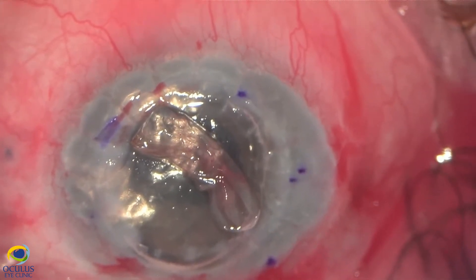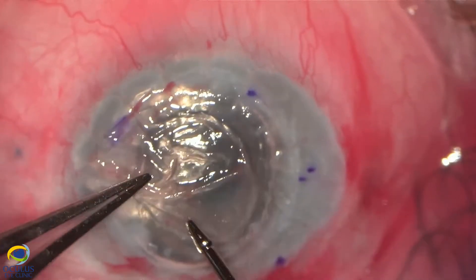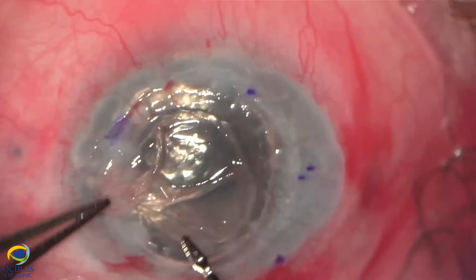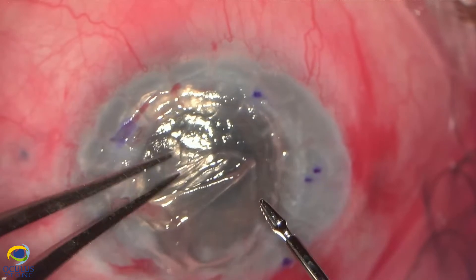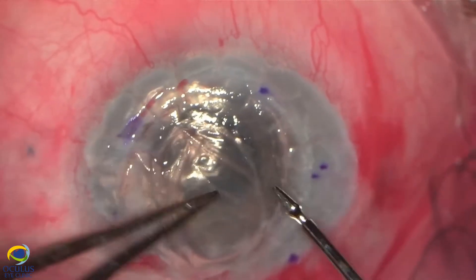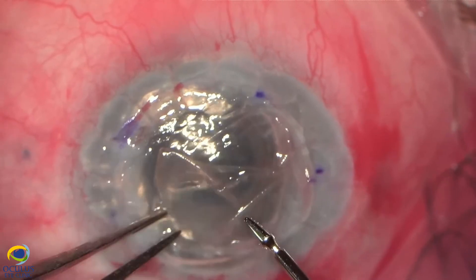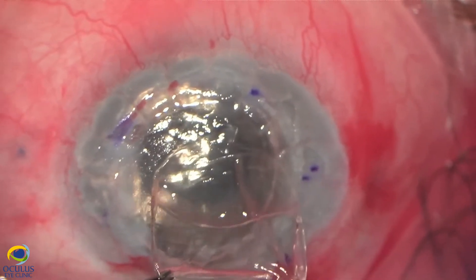The Descemet membrane looks quite thick, which is most probably due to the fact that the graft failed three years ago but the patient postponed the surgery for a new graft. You can see it very well here as a single piece.